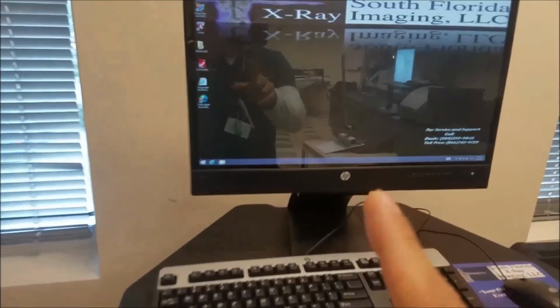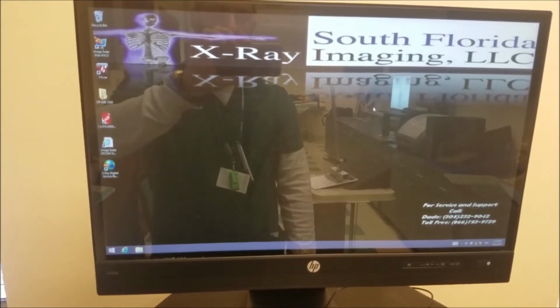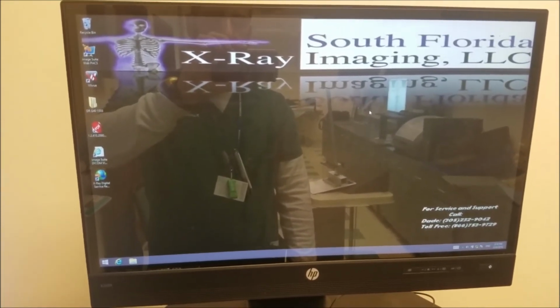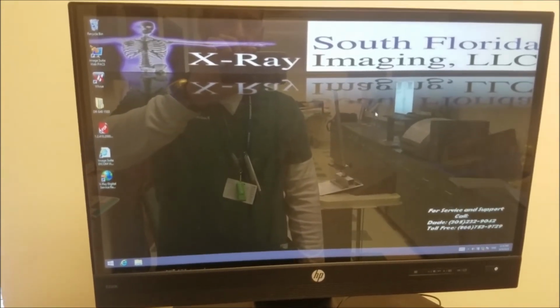First, an image will be taken. This image will be sent down here into our Bucky. Once the image has been taken, it will be directly sent over to our monitor here. This system needs no film or cassette and can be referred to as a filmless system.